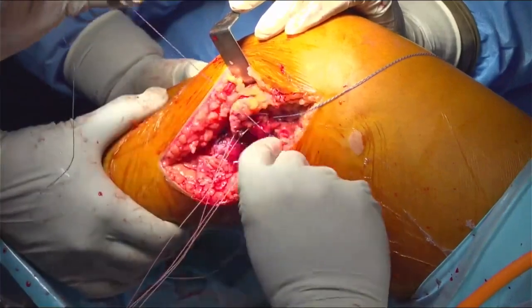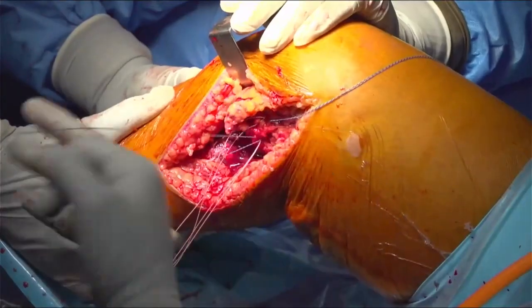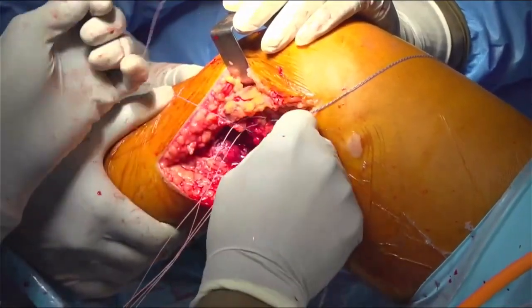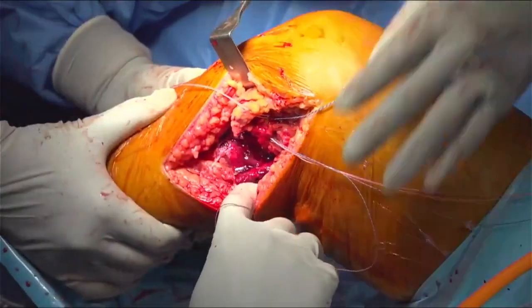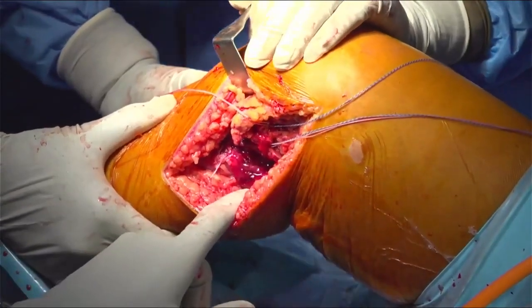So this way we have closed the meniscotibial ligament along with the meniscus into its place. And now there is a posterior layer as well. So this is the posterior layer.